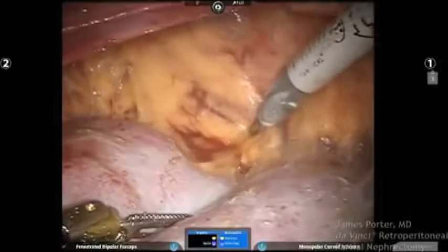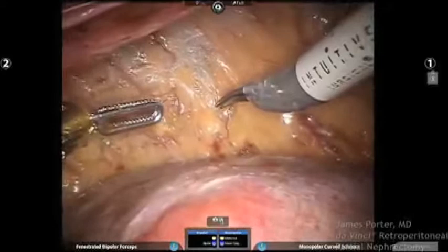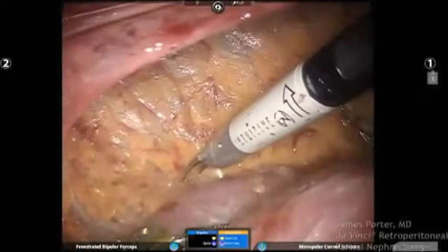So what would happen if you get into the peritoneum right now? I mean, people talk about converting to a transperitoneal approach. Does it change much, or what has happened when you did get into the peritoneum and you get peritoneal insufflation? Yeah. Well, I get kind of upset. I cry usually, because it does change the case.